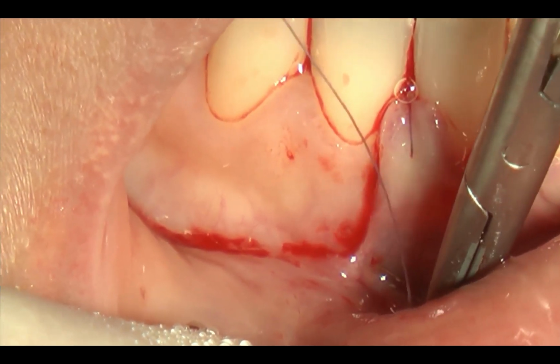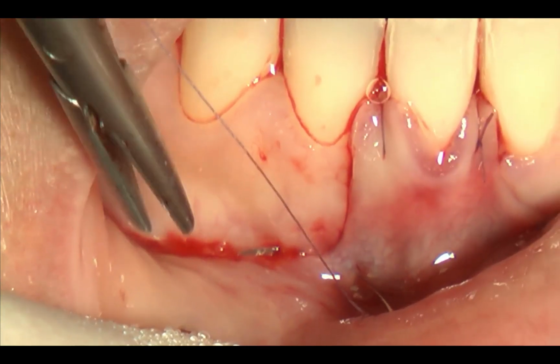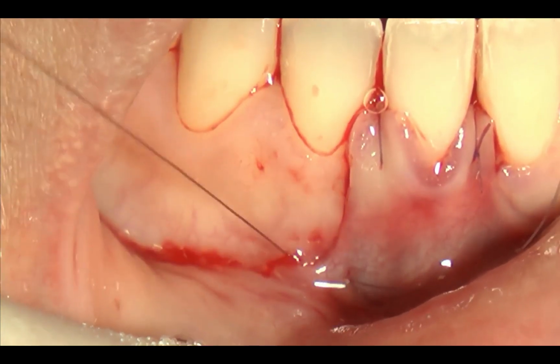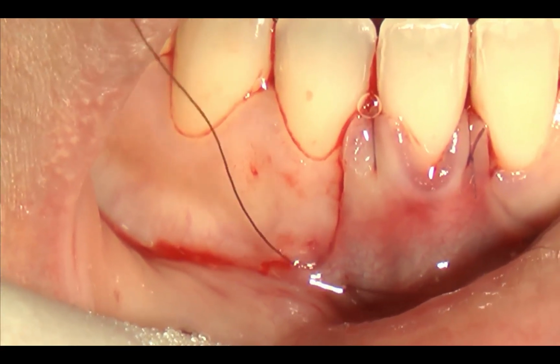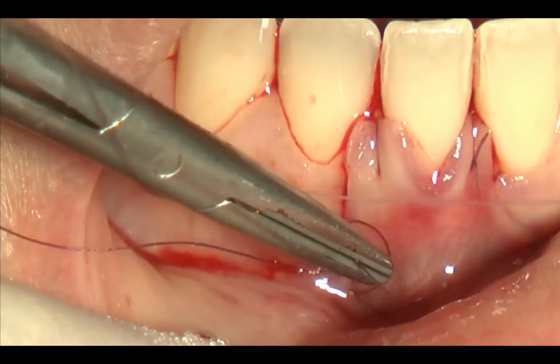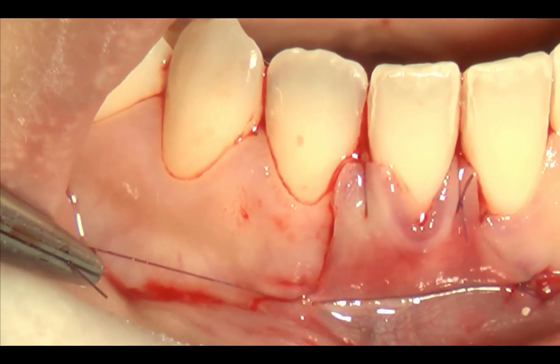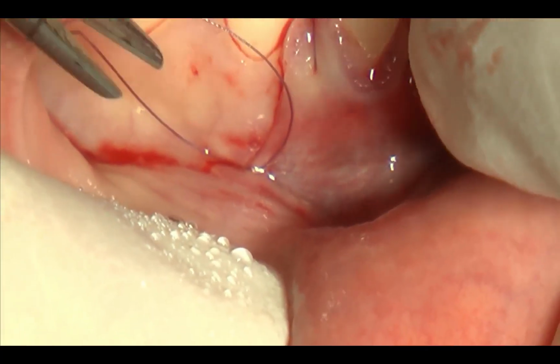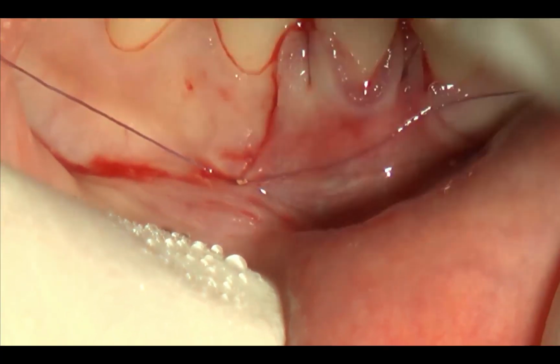And at the same time the adjacent soft tissue in order to block also the base of this pedicle. And now the verticality of the vestibulum can be rebuilt.